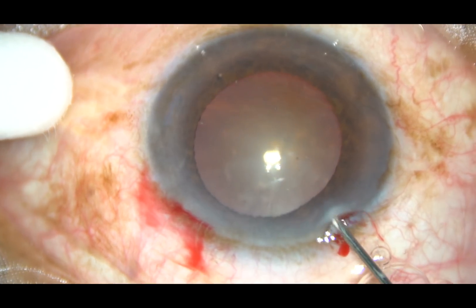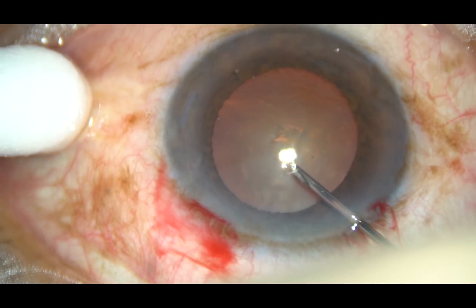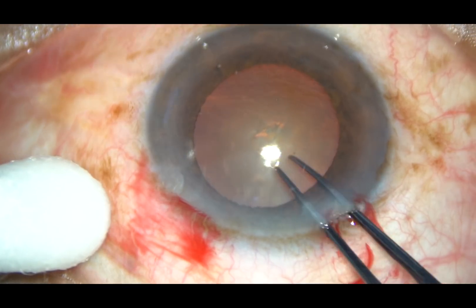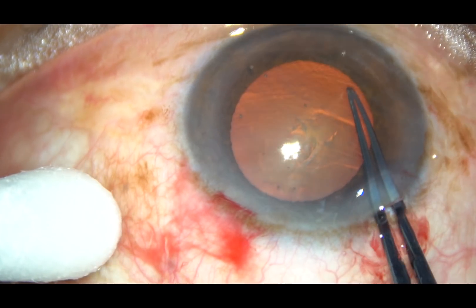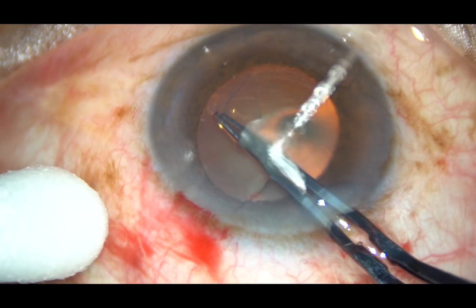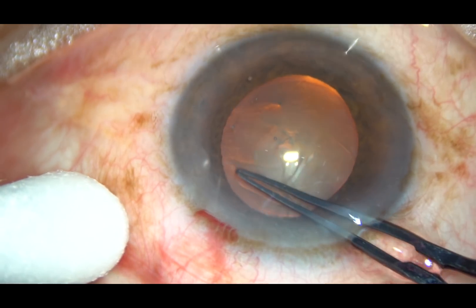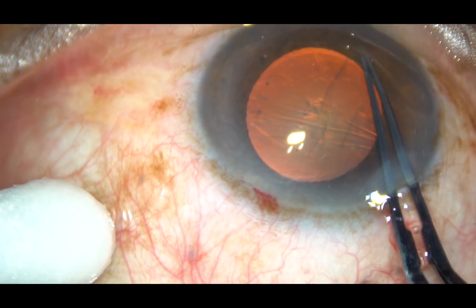You can see that the pupil has dilated quite adequately, but you will see what happens as soon as I start managing the nucleus. By this time, the incisions have been made and now the rhexis is being done. Since the pupil has dilated up to about 5 millimeters, the rhexis is going along the border of the pupil. That's it — the rhexis is done.